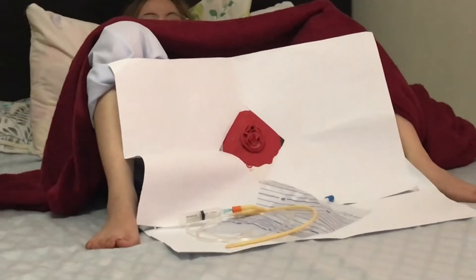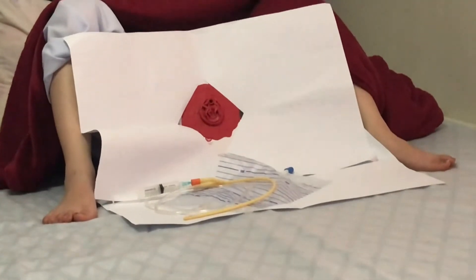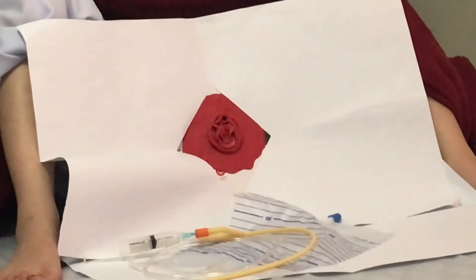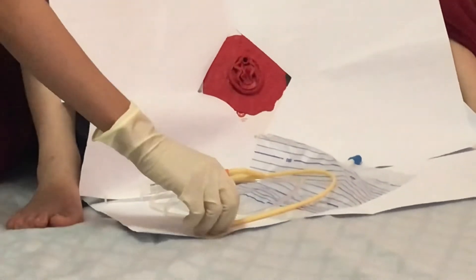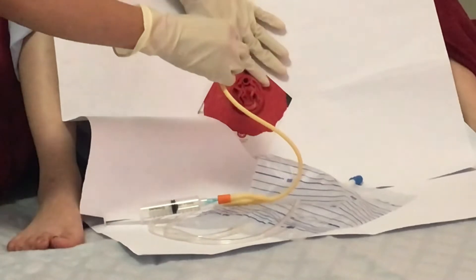Ask the patient to bear down. With the sterile-dominant hand, slowly insert the catheter into the urethra until urine flows, then advance the catheter 1 to 2 inches more. Do not force the catheter into the urethra. Okay, ma'am, can you inhale deeply?